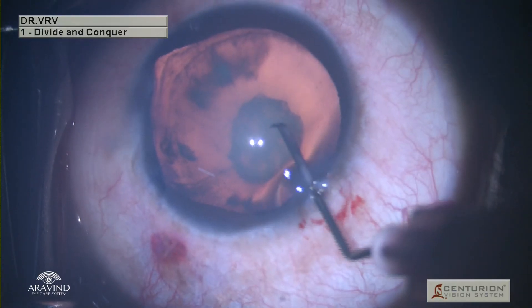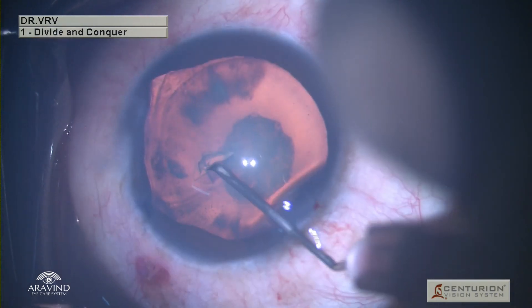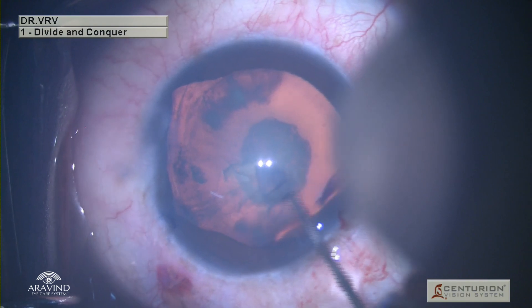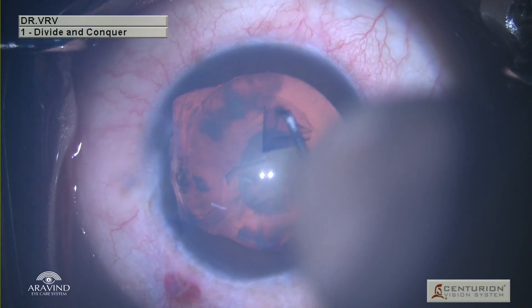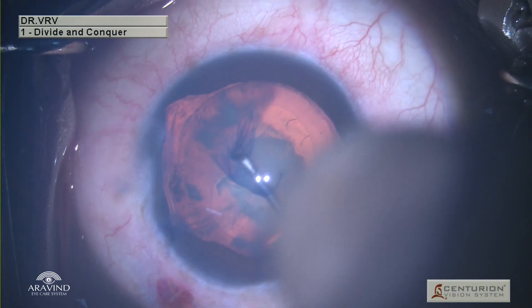With the help of a bent cystitome, a rhexis is initiated from the center. As this case has some zonular dehiscence inferiorly, rhexis has to be done very carefully. If you are going to have a large rhexis, placing a CTR will be difficult. Starting from the center, a flap is raised towards the 5 o'clock position and gently rhexis is completed. The size of the rhexis is around 6 mm in this case.